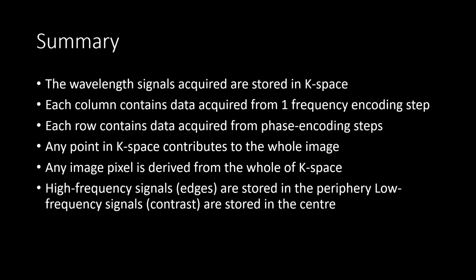I hope you understood. If you have not understood, please go back and see my previous videos on MRI basics, where I have explained how to select a slice, how to select a frequency gradient, how to select a phase encoding gradient.